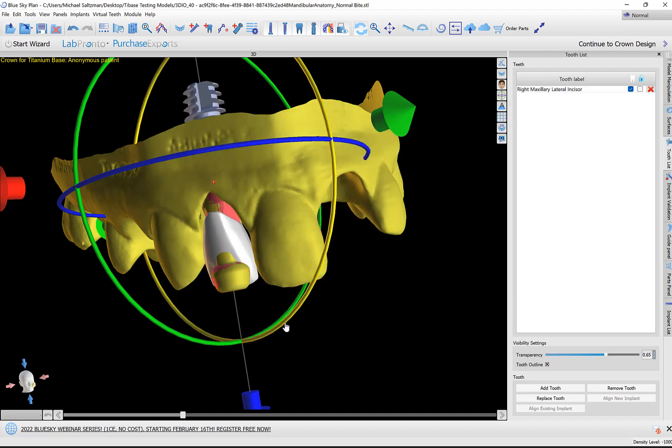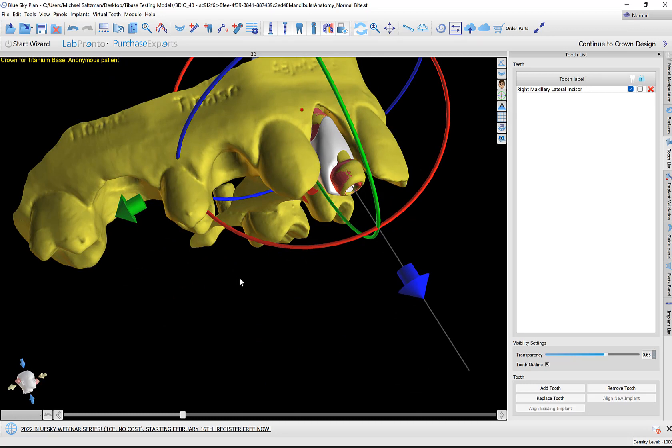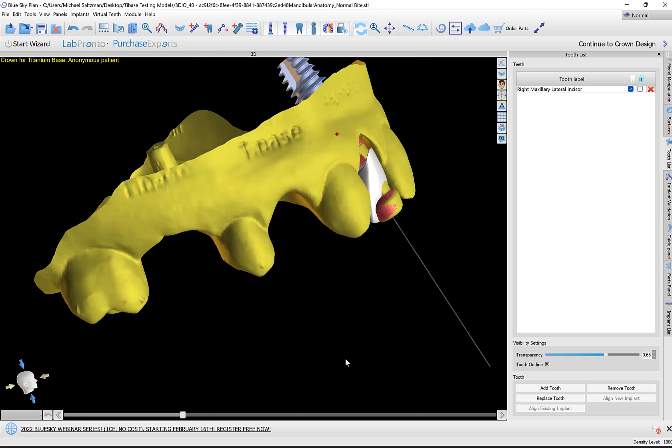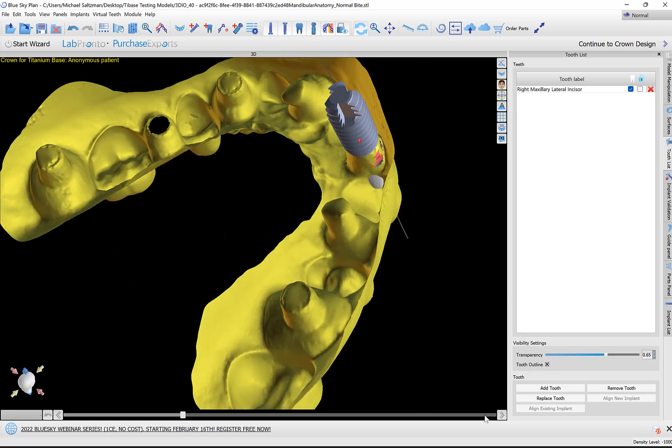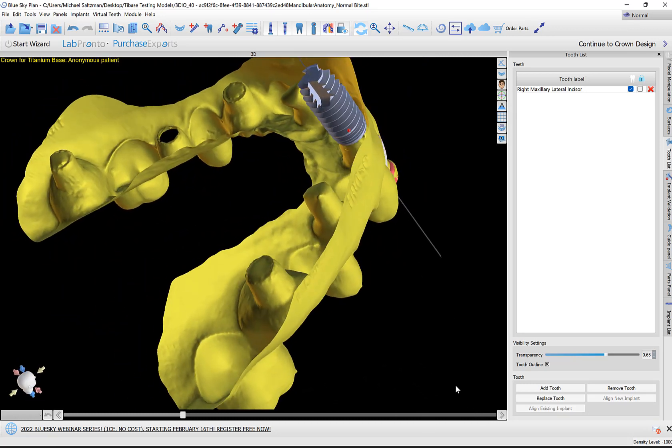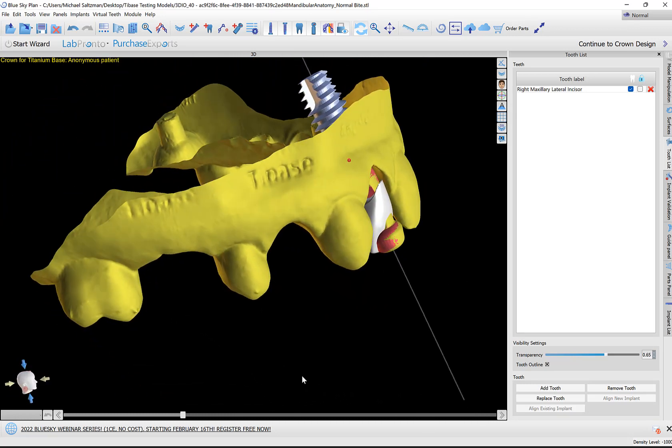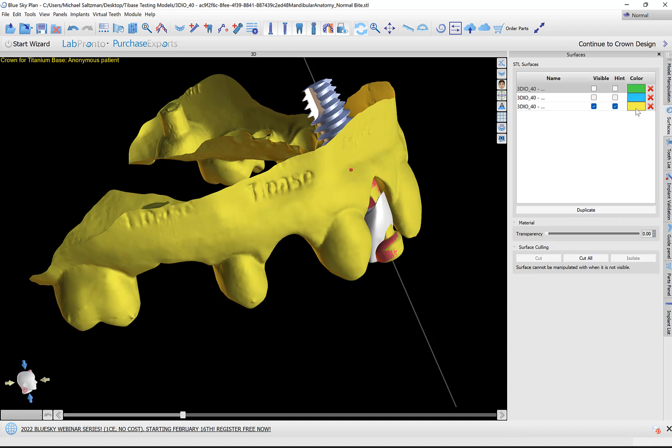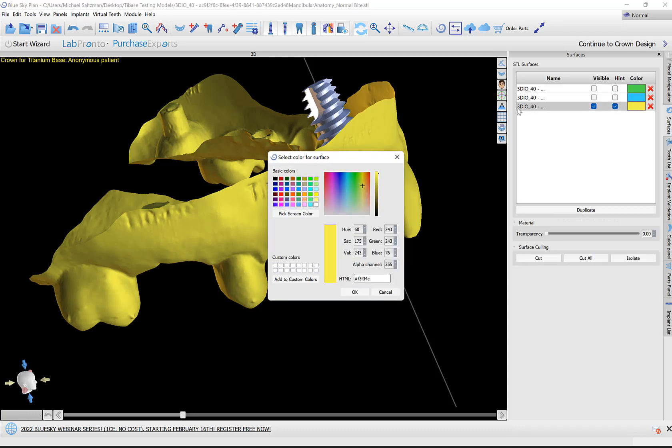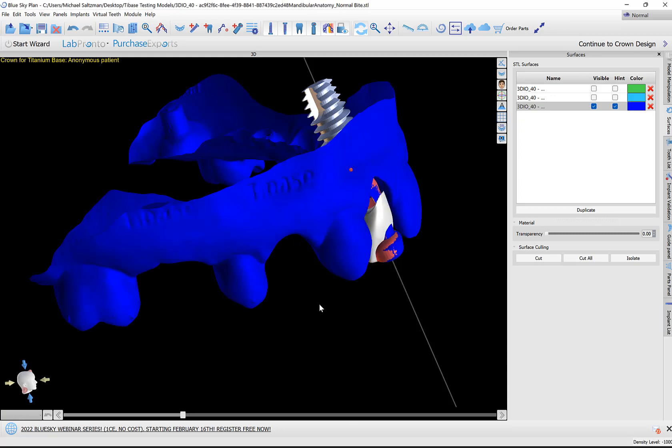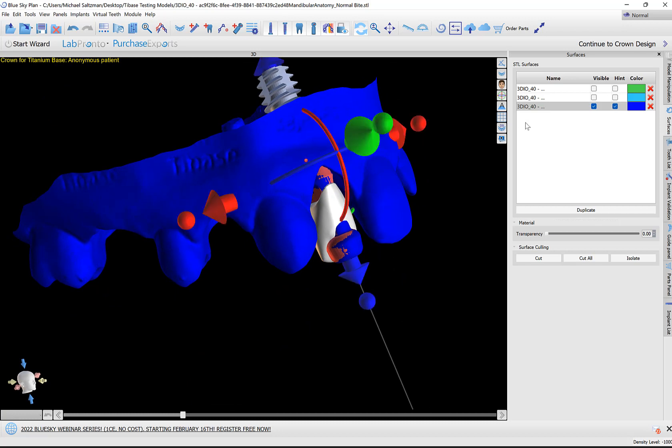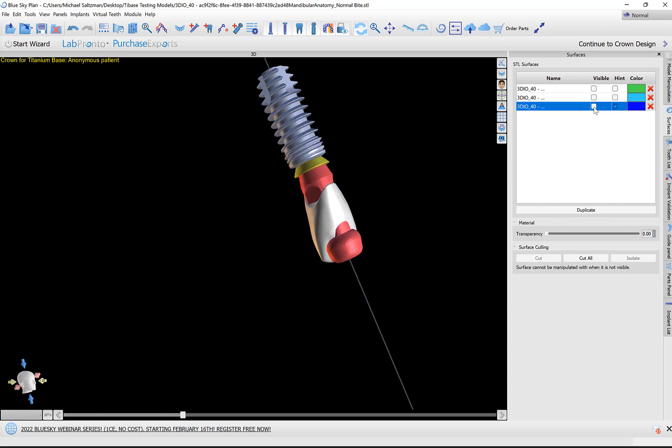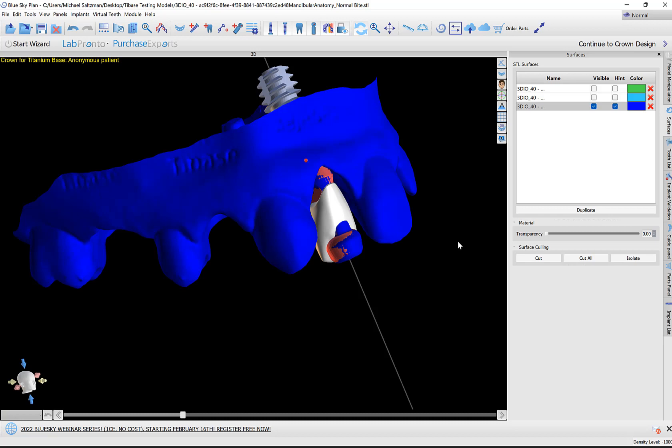The software now aligns a tooth, implant, and abutment. Let's change the model color. Simply click on the color, select a different color so we could see our abutment as well. Here we can see the abutment, the scan body, the implant, and the tooth.